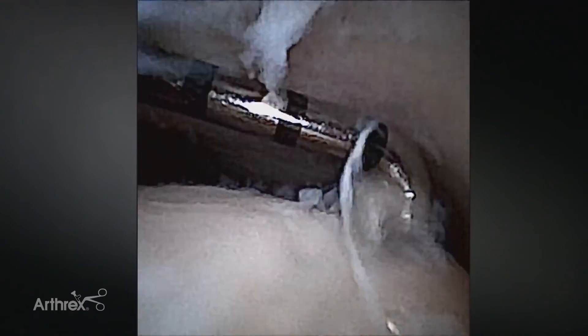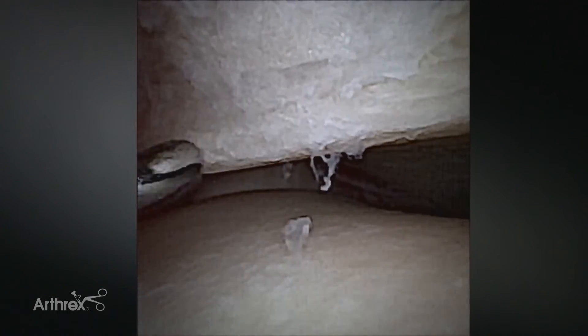We can look down into our medial gutter, way down in through there. She has a little osteochondral defect right here on the medial dome. So if we were to treat this, we could use our scope in this portal, then change our scope into the lateral portal and curette and microfracture that. Sometimes we'll use a heavier shaver or an abrader to remove some portion of the anterior aspect of the tibia if someone has an exostosis anteriorly or impingement syndrome. Then I can rotate and shift my scope into the lateral portal to get a better look at the medial side and debride any more tissue as needed.